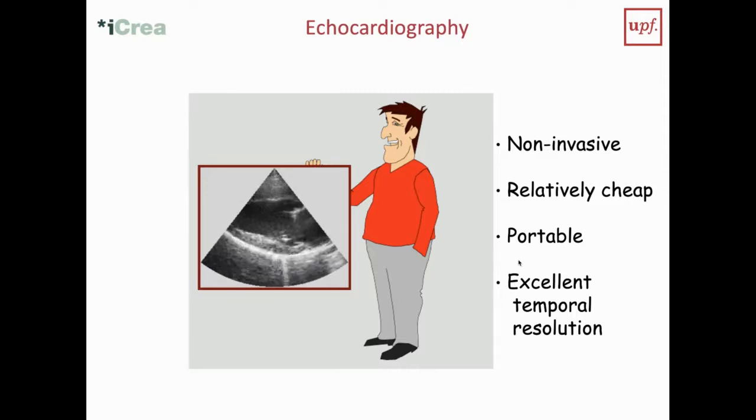So, for example, currently in clinic here in Barcelona, we have one dedicated scanner for cardiology, and dedicated means that half of the time we can use one MRI scanner for cardiac applications. And the other times it is being used for brain or bone or muscle, or kind of joints or muscle, because bone, of course, you cannot see, or abdominal scanning or something like that.